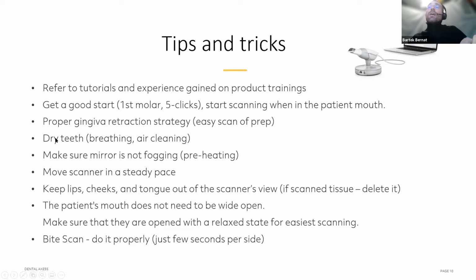Very important is to have the teeth dry. So basically, scanner can go through some surface of the saliva, but you may have your image distorted, so it's going to be quite slow. So it's always advisable to dry the teeth, even if you need to stop your scanning for a few seconds, put the scanner to the holder, use some air, and dry the teeth. So the most problem we have with the scanning experience is that dentists are trying to scan the teeth that are full of saliva.